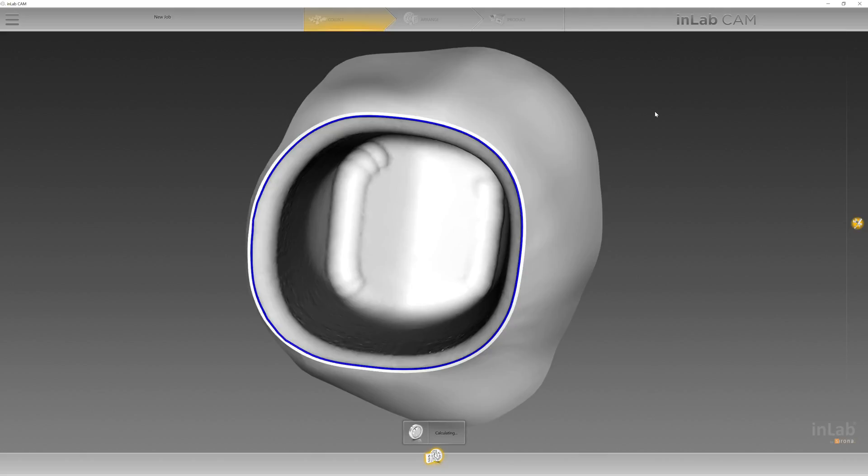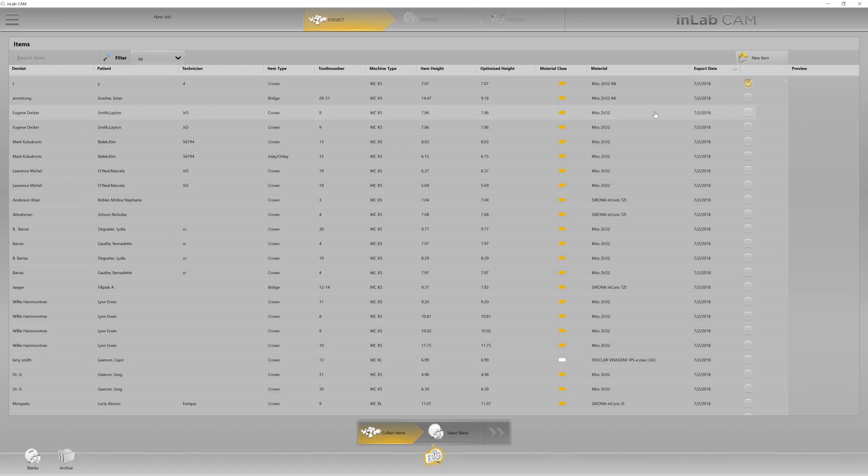After this, you're simply going to go to the blank screen. Select your blank in order to mill and just proceed forward as you normally would with any other crown.